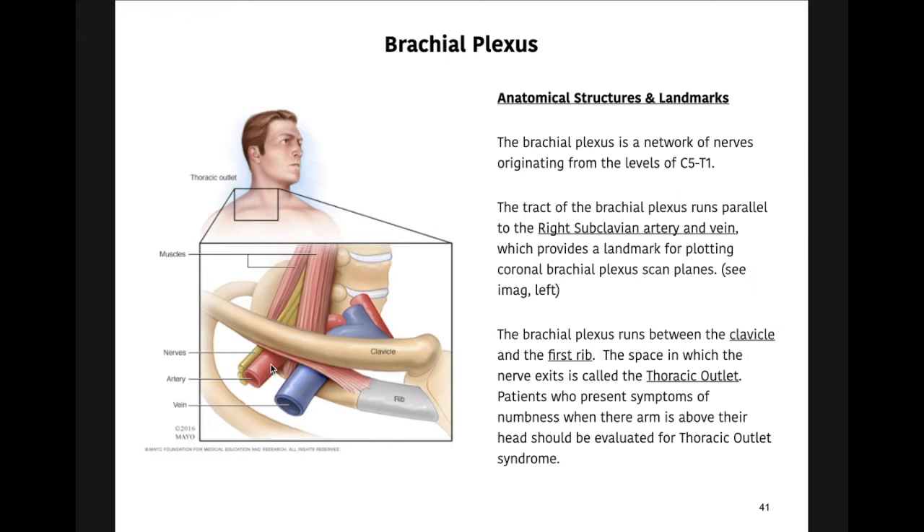The nerve runs posterior to the artery, and it passes through the first rib at the inferior aspect of this region. The superior margin is the clavicle, so it passes right through that little junction. That junction is referred to as the thoracic outlet. You may have heard of a pathology called thoracic outlet syndrome.